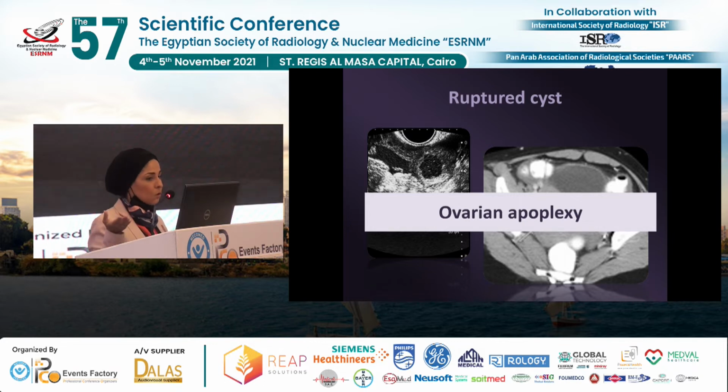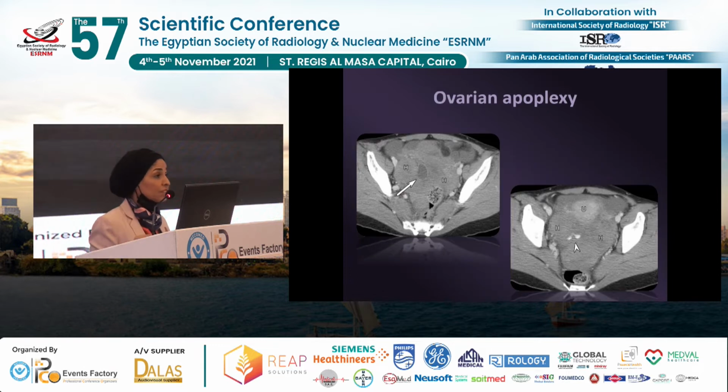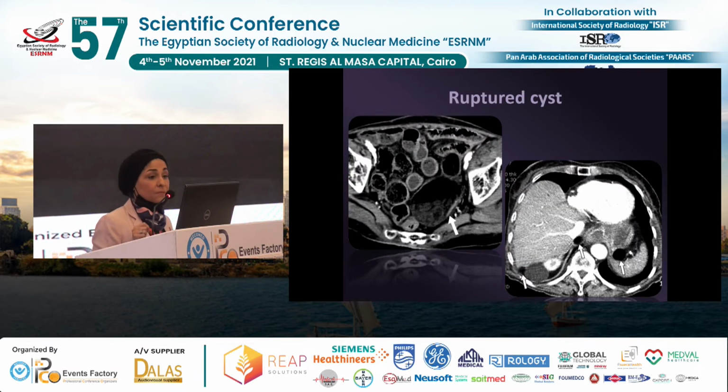Sometimes when you find that it's increasing, or even if your fellow clinician doesn't want to wait for the increase, you can do CT with contrast and look for active extravasation on the delayed images. If you find this cannot be managed conservatively, he has to go in by laparoscopy and ligate it.